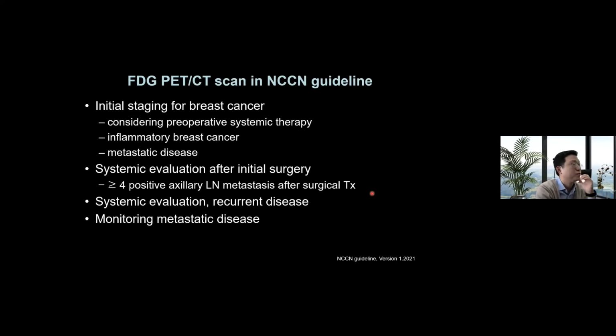And now I'm going to talk about the FDG PET scan in the staging system. This is, again, the summary in the NCCN guideline. I looked for all the PET scans in the guideline, and this is the summary of that.